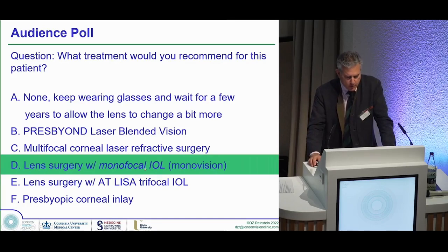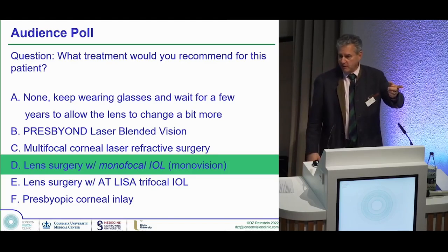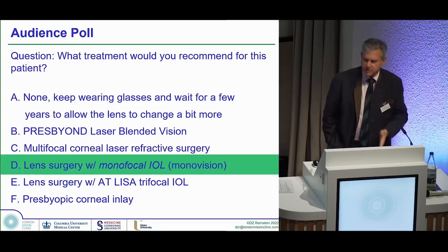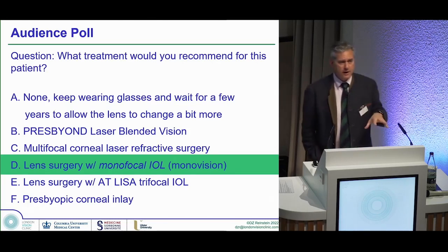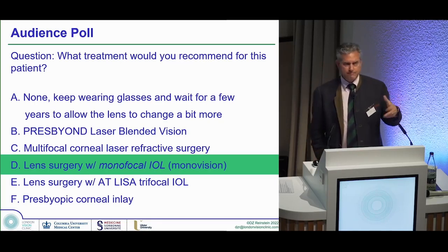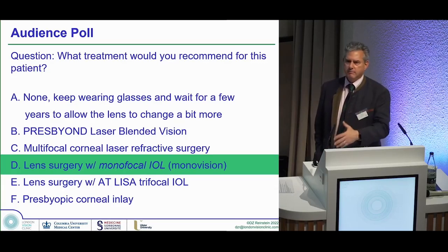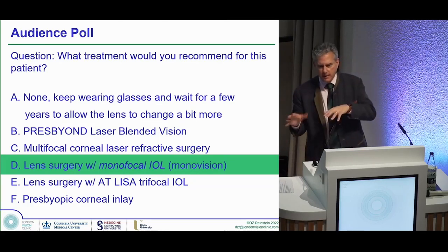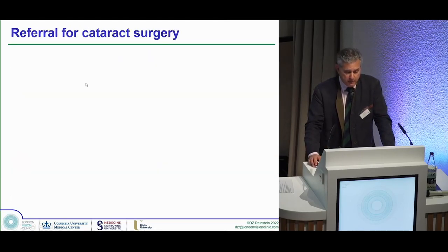Well, we did lens surgery with a monofocal IOL, but he lives in Florida, in Clearwater, Florida. Is that near you? About 2 hours. Okay, well, he had an ophthalmologist in Clearwater. And I called the guy and spoke to him, and I said, look, this is what I need you to do. I've looked at his spherical aberration on the cornea. What I need you to do is target the right eye at +2.375, and the left eye at +1.4 or something. I calculated what I needed for the post-op hyperopic outcome so that I could then do PRESBYOND and get the best out of him.